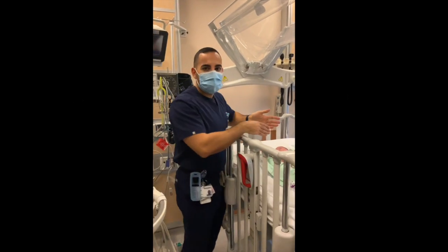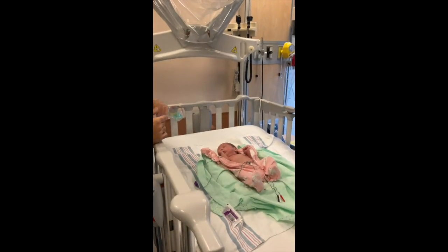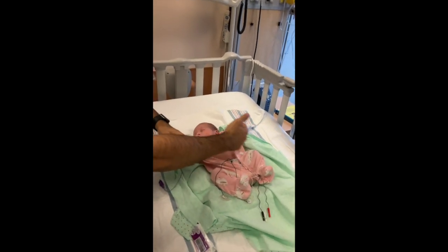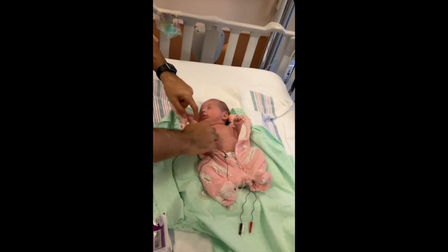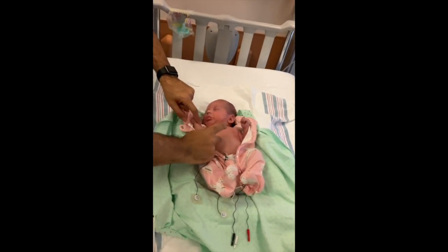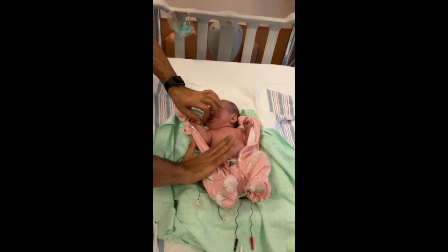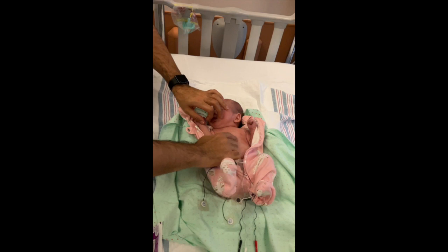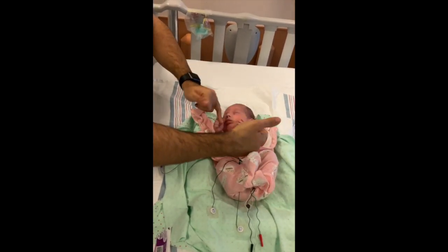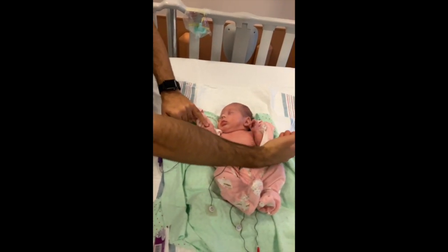Here I'm going to show Anne Florence, our baby who accepted to be part of the recording. We're going to look at the chest landmarks. We have the nipples here, we have the clavicles here, and the thoracic cavity ends here with the costal margin. The chest is divided into six zones: the zones on the right side of the patient and the zones on the left side.